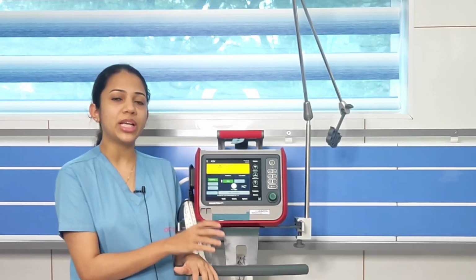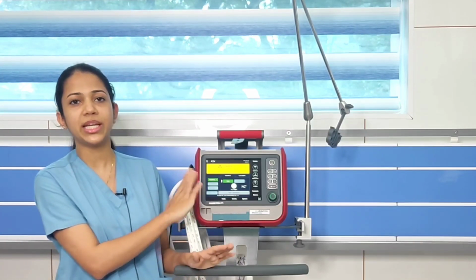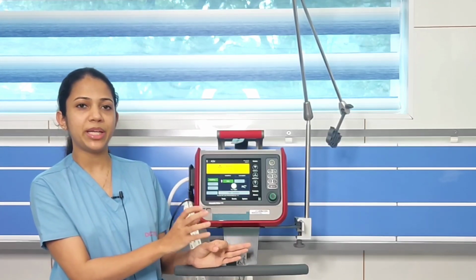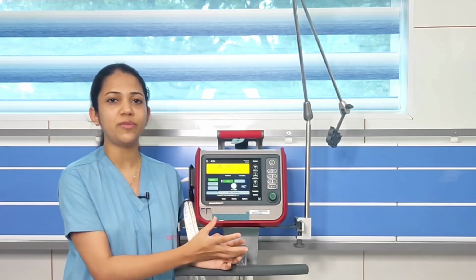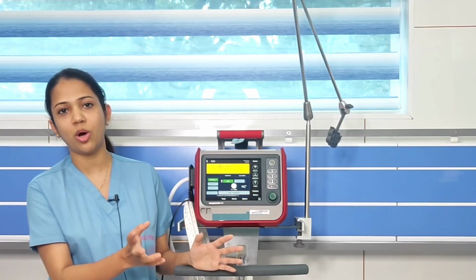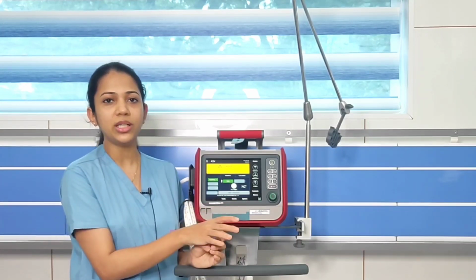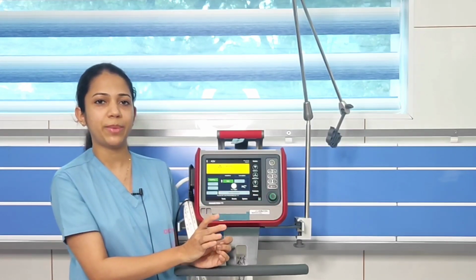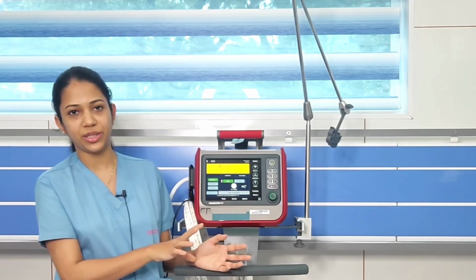As I told before, immediately after intubation we put the patient on any mode, that is CMV mode, pressure support mode, depending on the need for ventilation. That means depending on the indication for which we intubated the patient, we can plan how long we have to keep the patient on a ventilator. Suppose we just intubated the patient for imaging purposes, we can put the flow trigger initially at 5, and whenever we are planning to wean the patient, maybe after 1 hour or 2 hours, we can reduce the flow trigger and plan on weaning the patient.